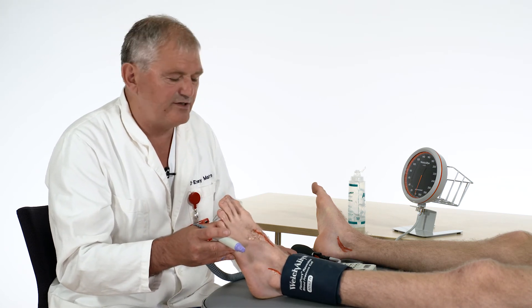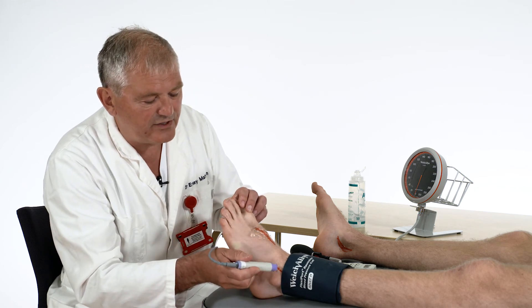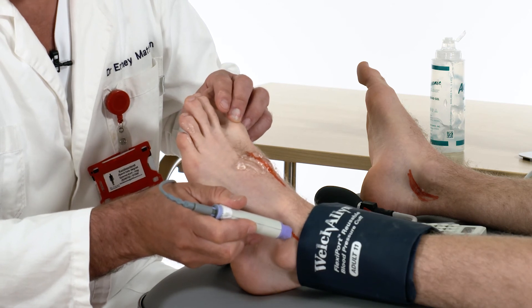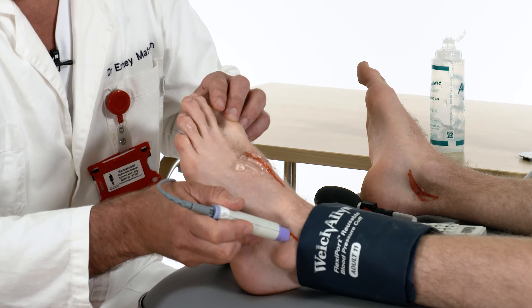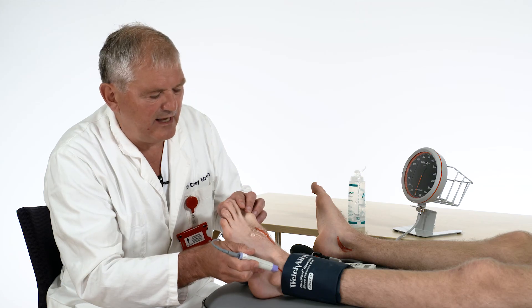In the case that the measurements you get on these points do not fit the clinical picture overall, you can also measure the pressure over the fibular artery, which is ventral to the lateral malleolus. Not seldom, this is the main artery in elderly people.